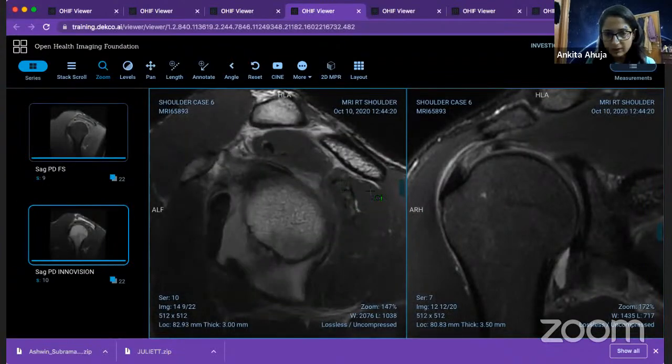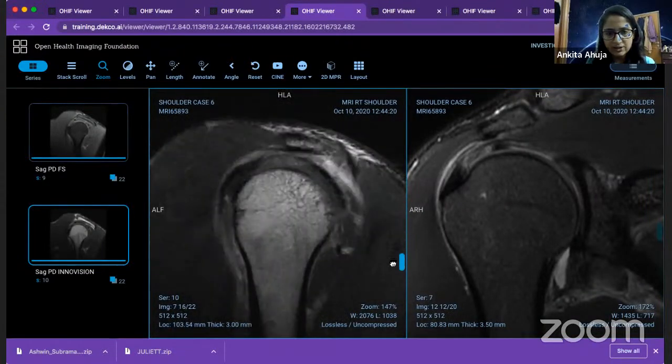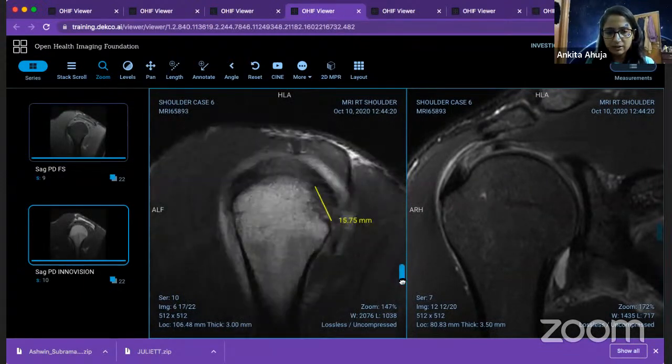So this is your supra, this is your infra tendon. You trace them on sagittal weighted images. This is your infraspinatus, and this is your increased signal. So it is an increased signal in the supraspinatus. Now, if this were a young patient, like 20 years, I would not go down and call this tendinosis. I would still think that maybe because this dislocation has happened, there might be a little stretch, and this might just be a contusion, right? So we leave it at that point.